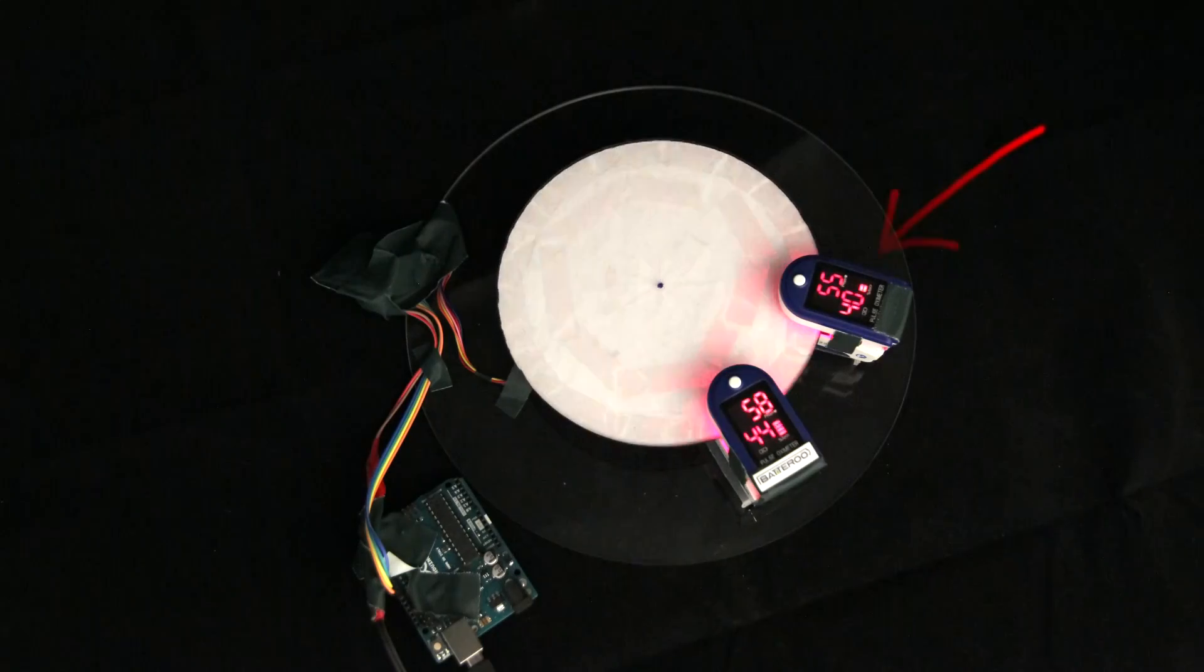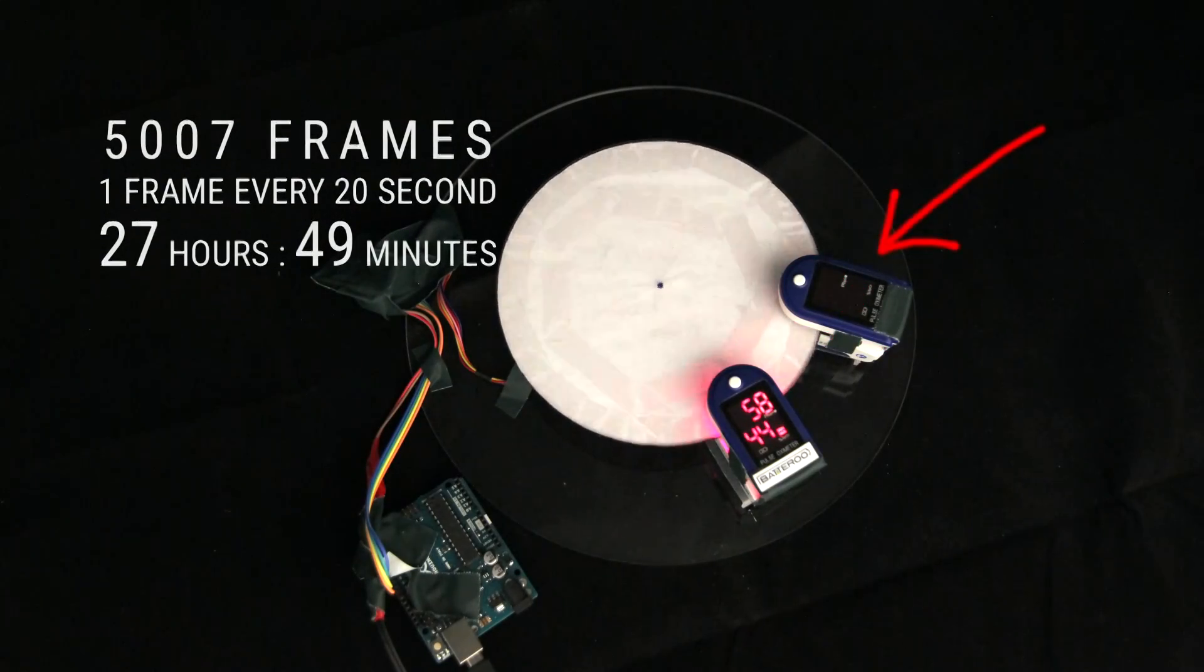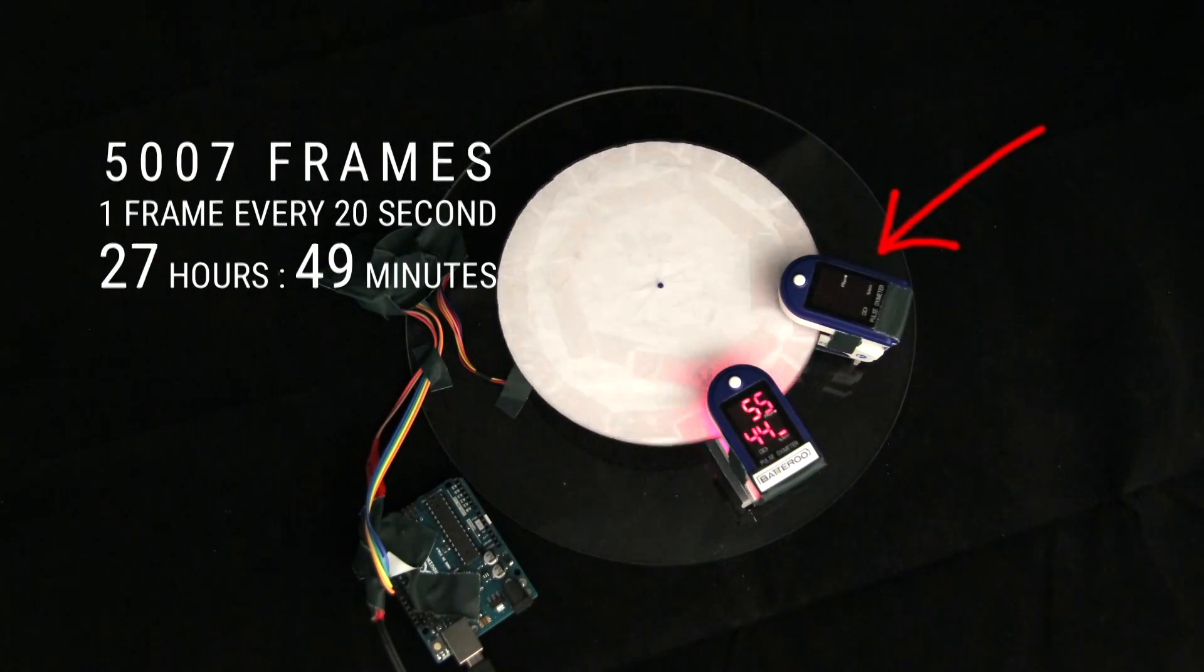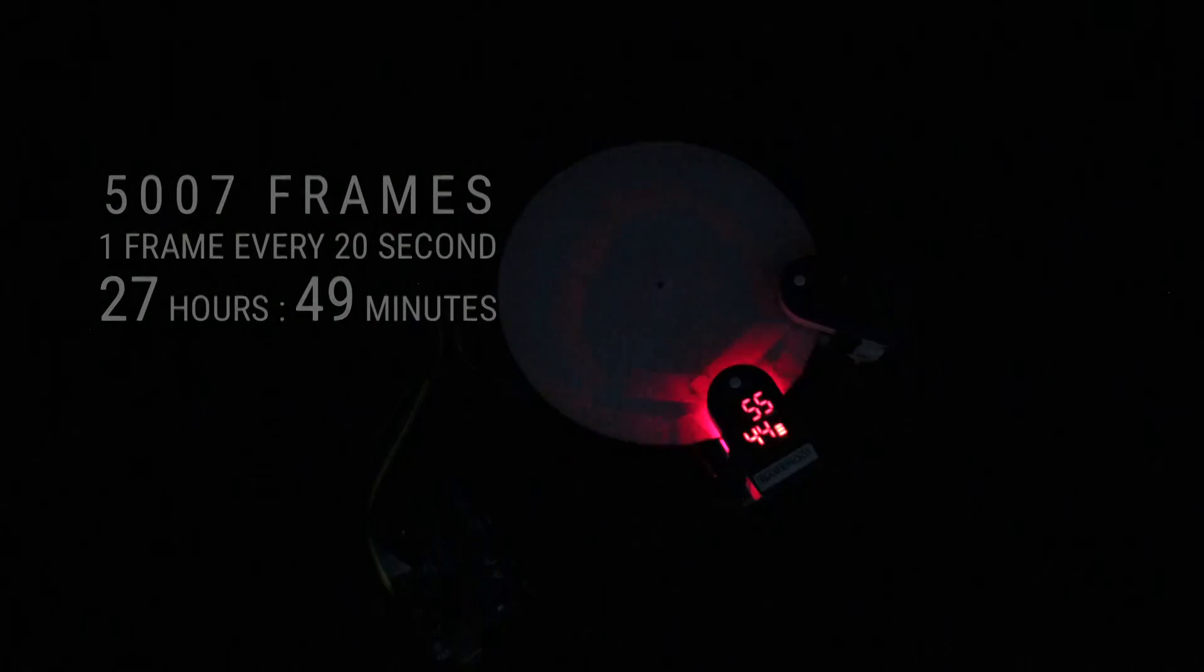The oximeter with batteries only stopped functioning after 5,007 frames, which translates into 27 hours and 49 minutes.